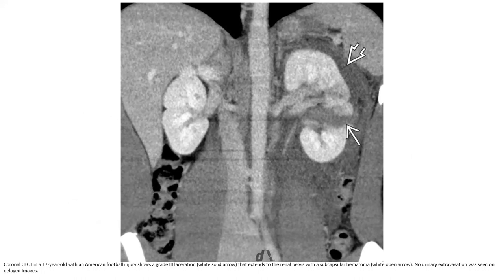This is a coronal contrast-enhanced CT in a 17-year-old with an American football injury, showing a grade 3 laceration extending to the renal pelvis with a subcapsular hematoma. No urinary extravasation was seen on delayed images.